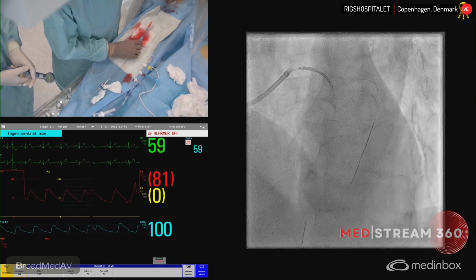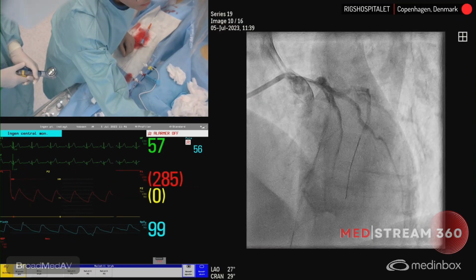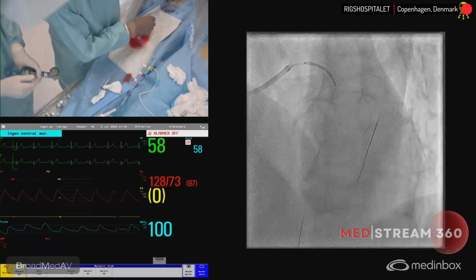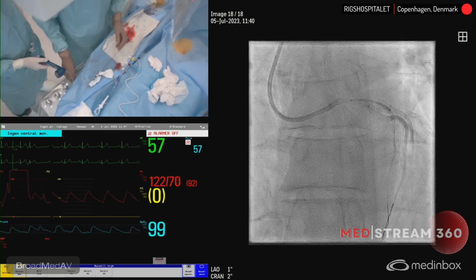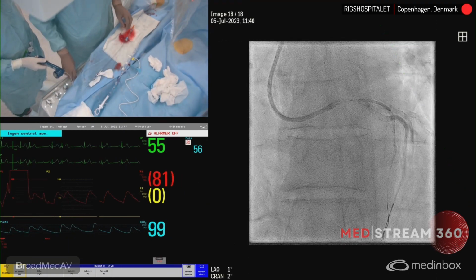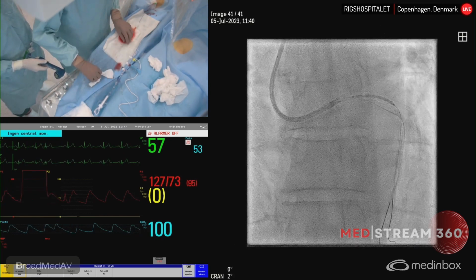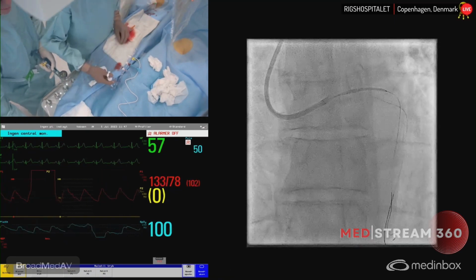The other angulation was actually a little better. The distal part is exactly where we want it. The distal part of the stent, based on you have pushed it 2 millimeters in. If you go now, you probably push the stent, yeah. But this projection was actually quite good for positioning. Yeah, it's actually quite good. This one, I still need to retract it a couple of millimeters. This is it here in this projection.